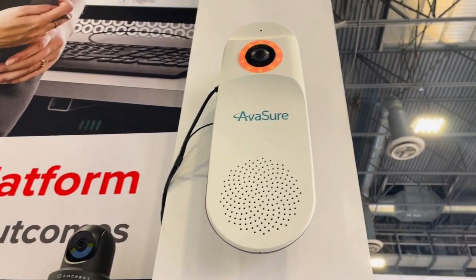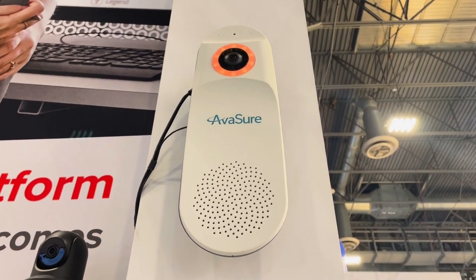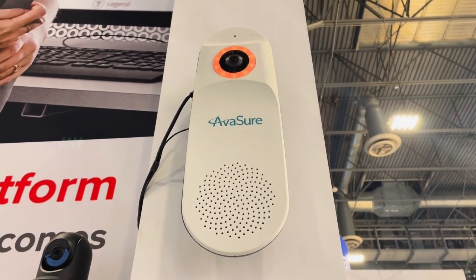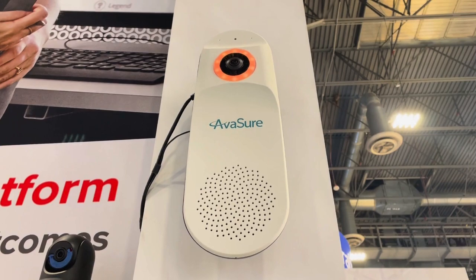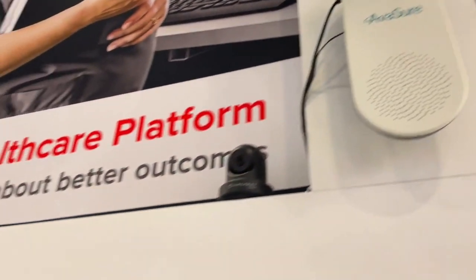I'm a Senior Solutions Architect with Ascom, and today we're going to review the AvaSure integration with Ascom. Up here on our top, we've got our AvaSure Guardian Access device. This device will typically be mounted in a patient's room and allows two-way communication between a patient and a telesitter that can be sitting remotely off-site.